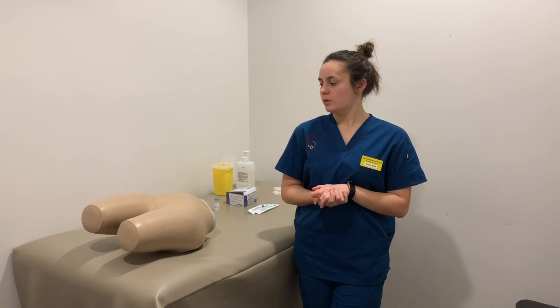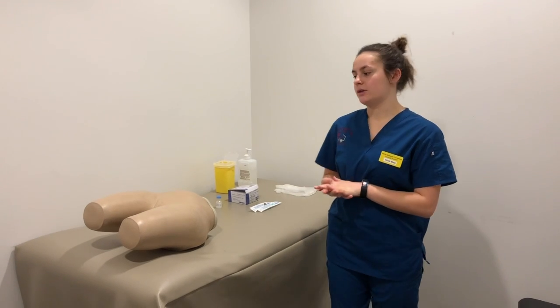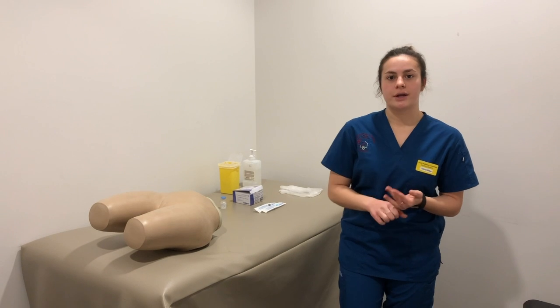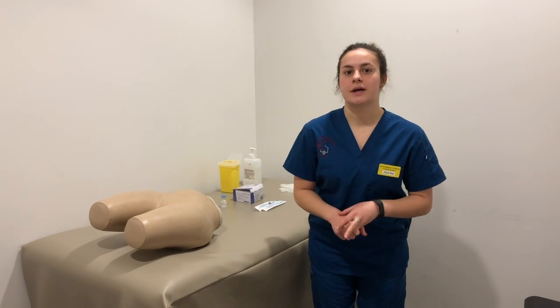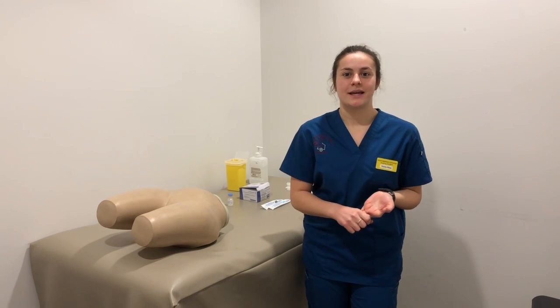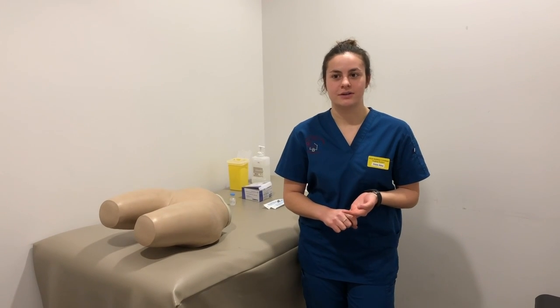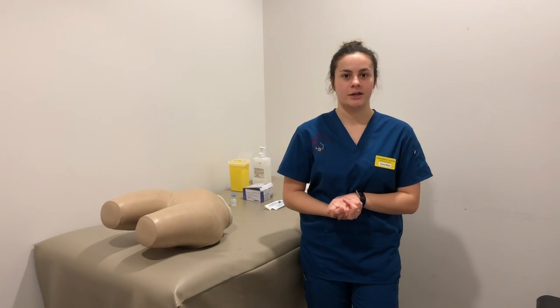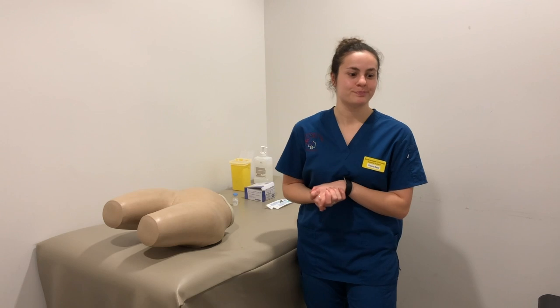So to begin, you want to take a look at your patient. You want to look at their body size and their mass, the level of fat or weight. This can help you to decide the needle size that you need, the gauge and the syringe size that you need when injecting the medication.